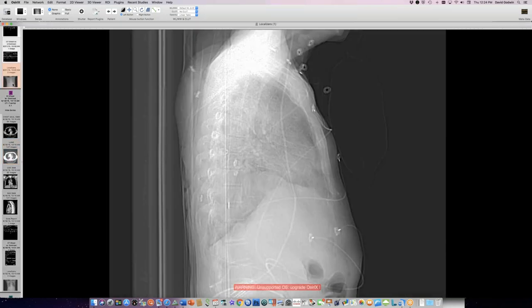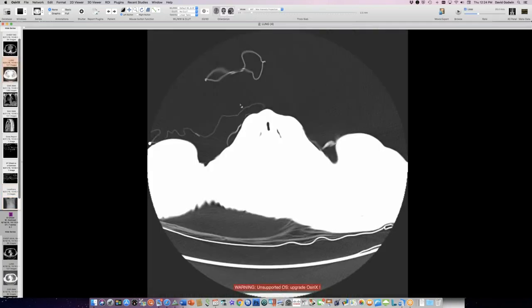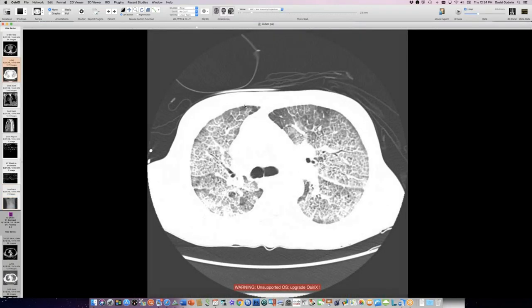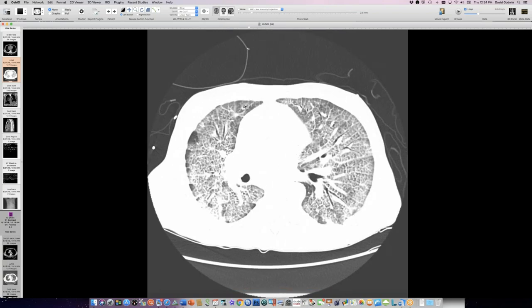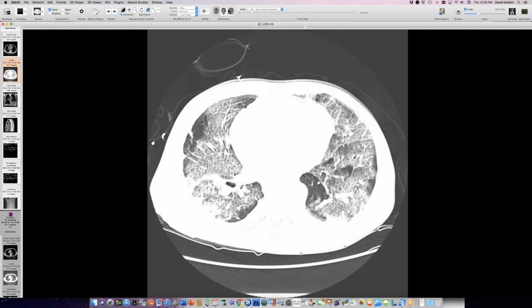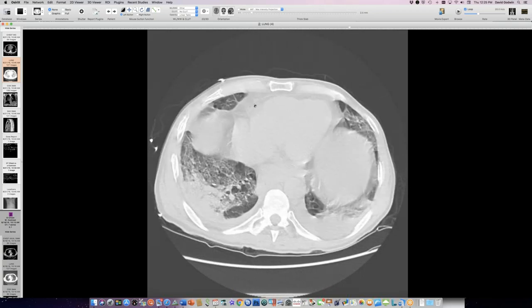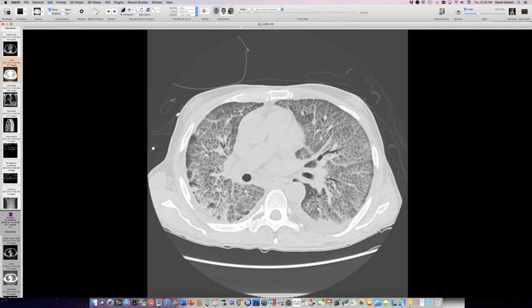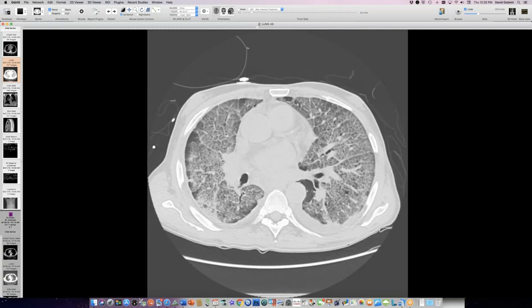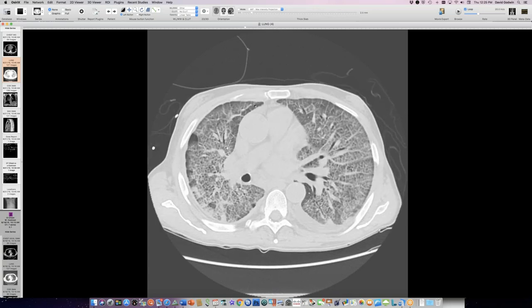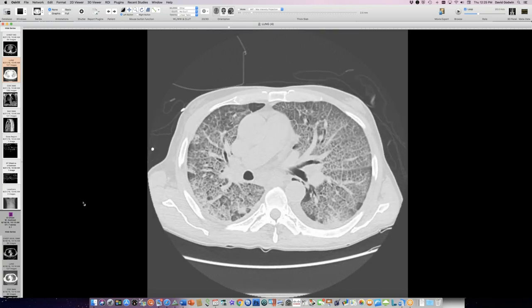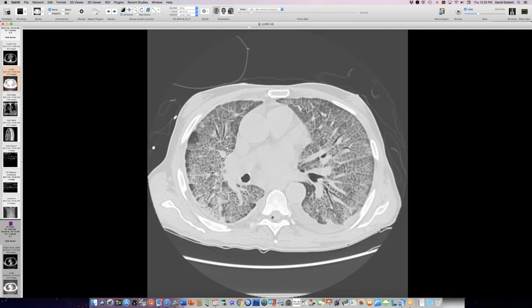Things got worse. A CT a few days later shows that in just a few days this has become confluent, but it's the world's nicest crazy paving pattern. This would have to be some acute, overwhelming inhalation of something. Maybe it's a vaping case. He's not a sandblaster — he's a truck driver. His wife says he's been losing weight for about a year, 20 pounds. He got acutely short of breath. This turns out to be Pneumocystis.